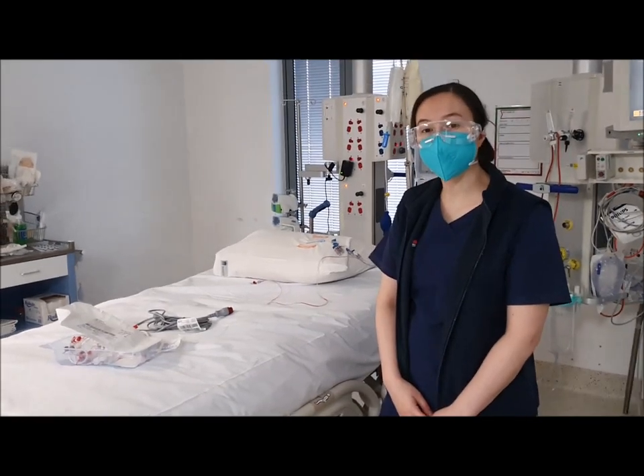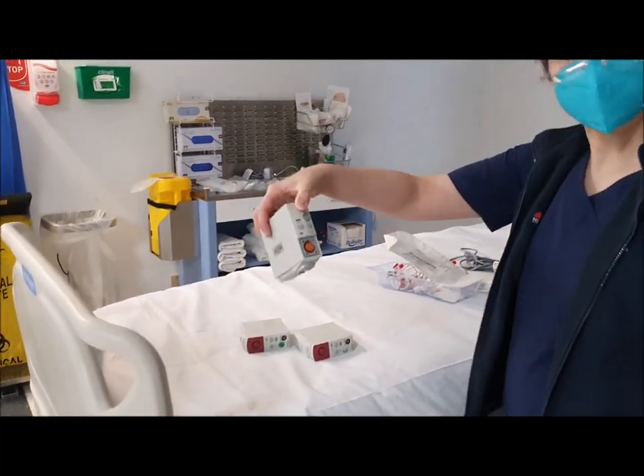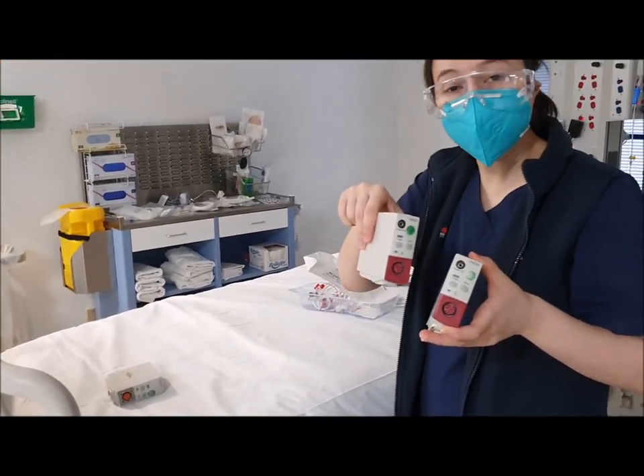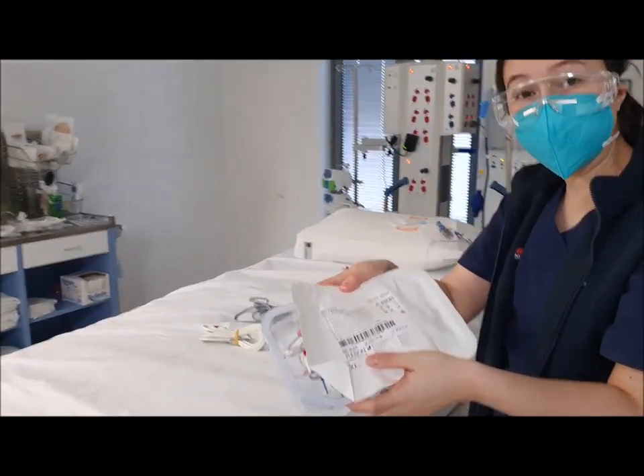Hi guys, this is the equipment required to set up Pico. You need one cardiac output module, which is labelled Pico. You need two standard pressure modules, and you need a Pico monitoring kit.